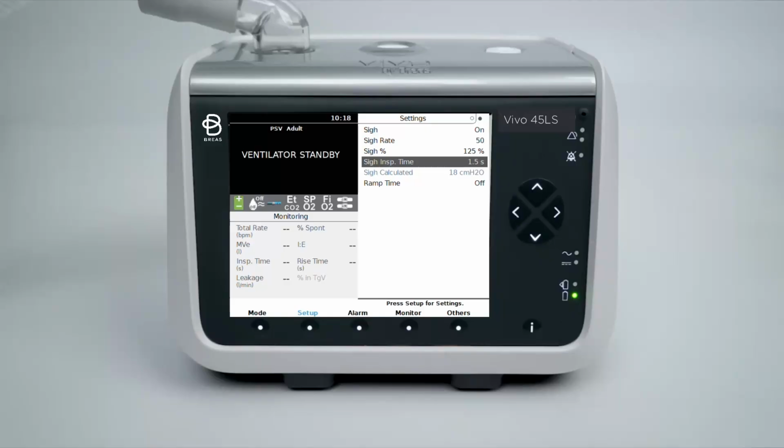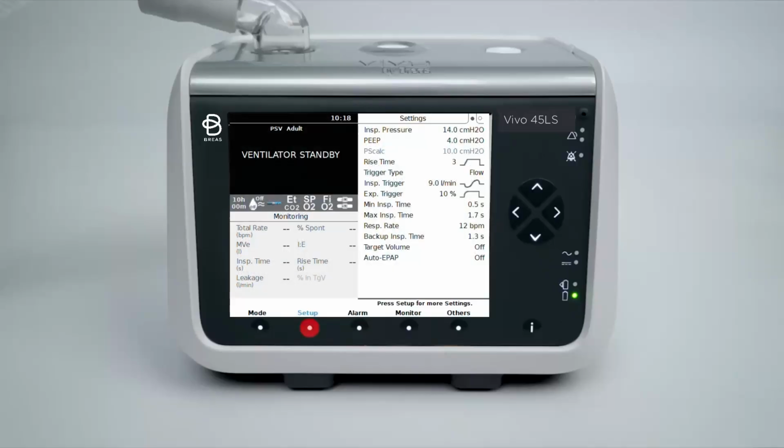Under the Setup menu, you find the ramp feature at the beginning of the treatment. Once you activate it, you will be able to set the ramp time and start pressure. Selecting and changing settings works in the identical way with the arrows up and down and left and right. Pressing the Setup button again will return you to page 1 as indicated by the tabs.